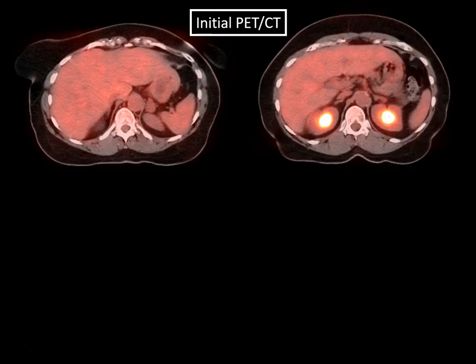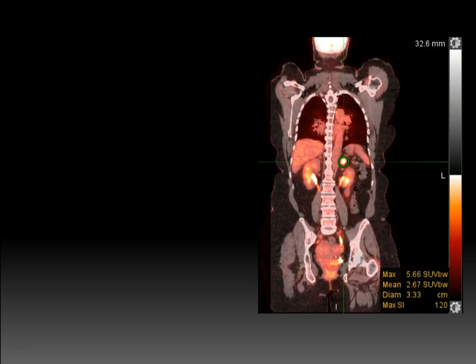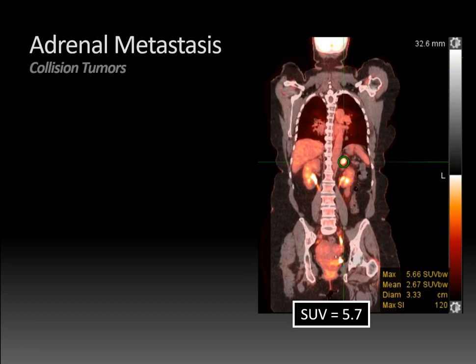The patient also had a PET CT for staging. You can see the larger and smaller left adrenal nodules, both with avidity similar to the liver — not more avid — and the max SUV was less than 3.1. However, on a follow-up PET CT done three years later, there's now increased avidity in the larger left adrenal nodule, whereas the smaller one is unchanged. Measuring the SUV gives 5.7, consistent with metastasis. This was a collision tumor.